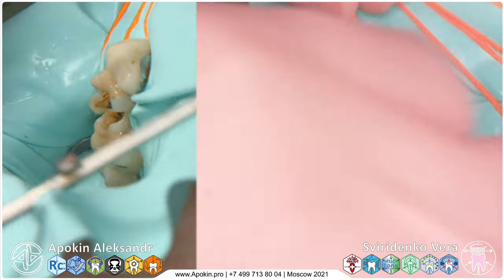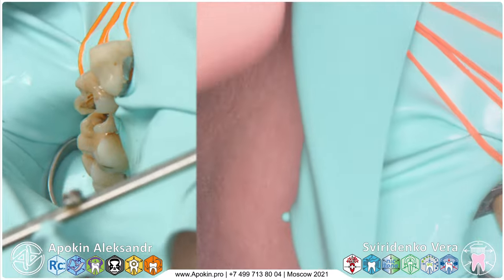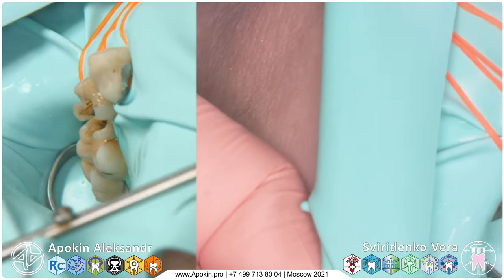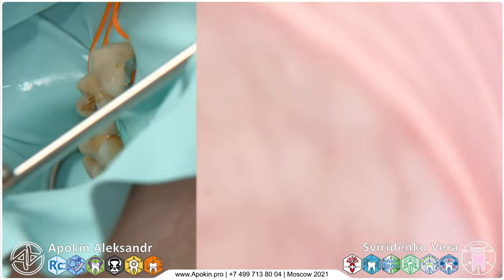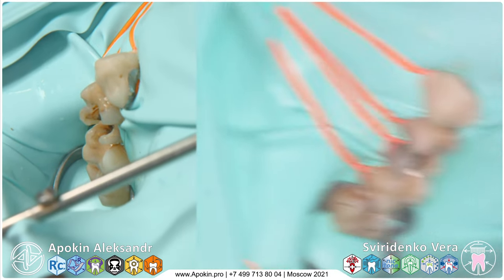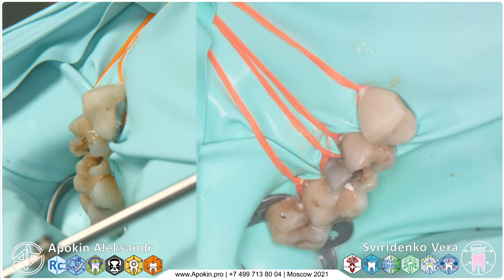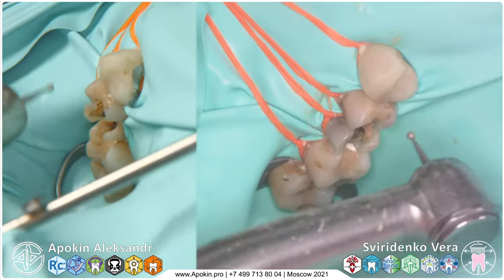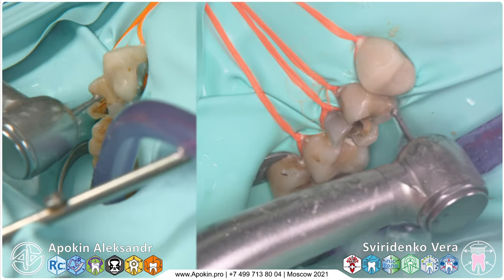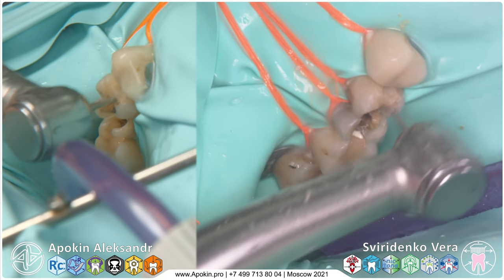We make a tension in the ligatures and fix them in this retainer on the frame. So we're ready to go for the next tooth.